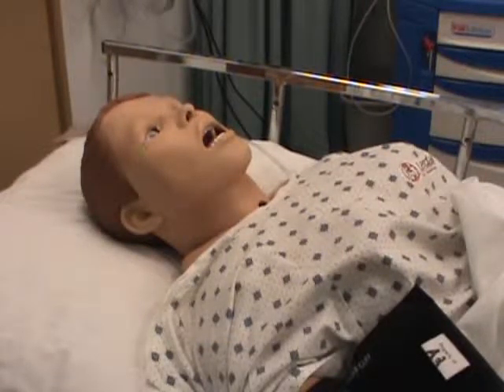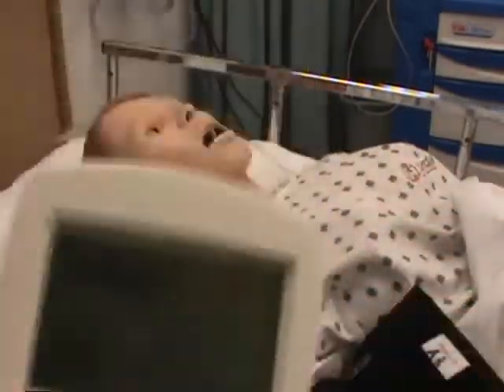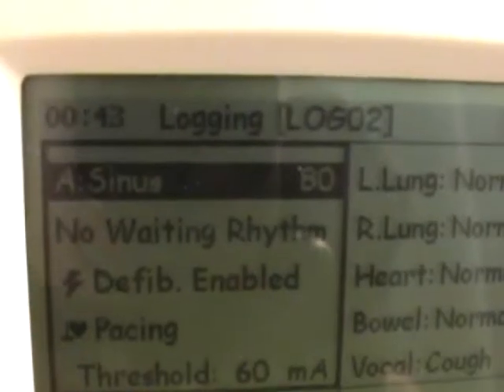Let's talk about setting heart rates and rhythms on the VitalSims mannequin. I've turned on my main power supply. After I turn on my remote, I get a default set of vital signs. In this case, talking about the heart, we get a sinus rhythm of 80.